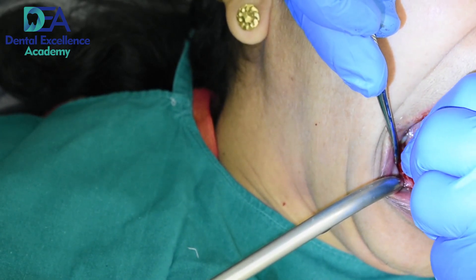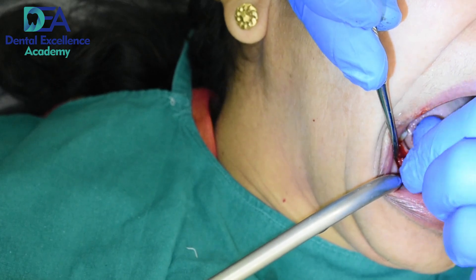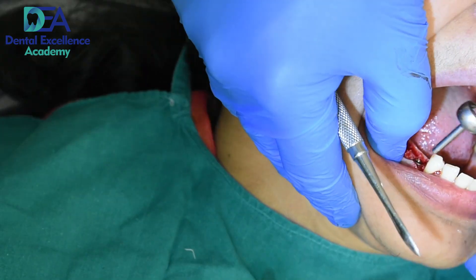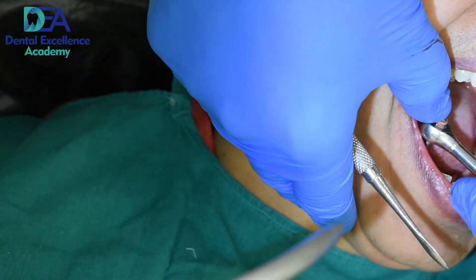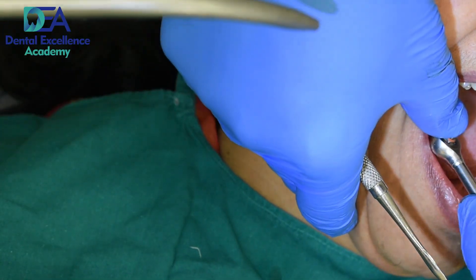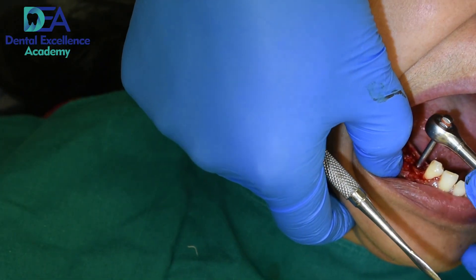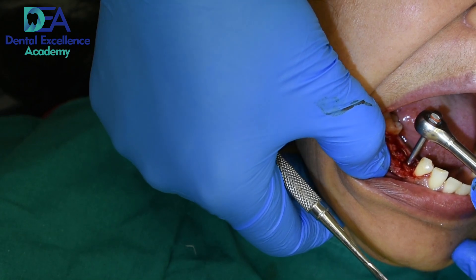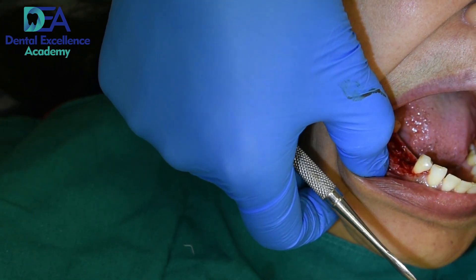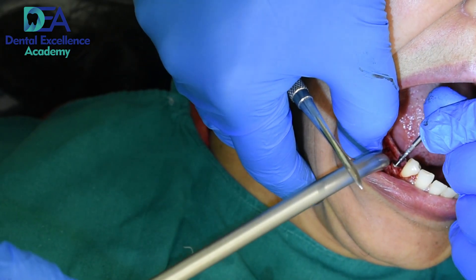Now it is going quite smoothly. With the help of a ratchet I am going to the desired depth. You have to be at least equicrestal, if not subcrestal. Now I am putting the cover screw.